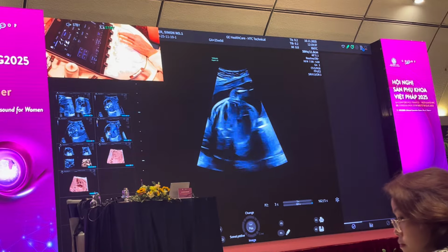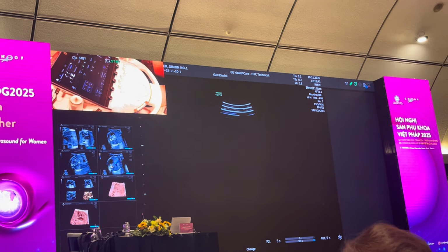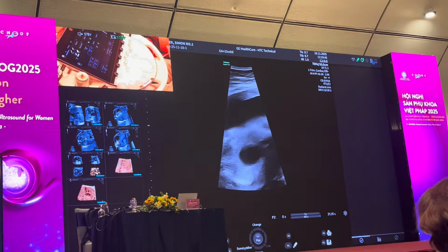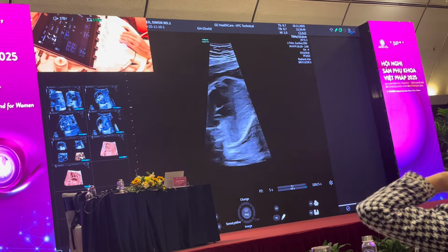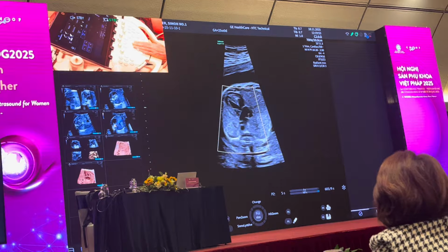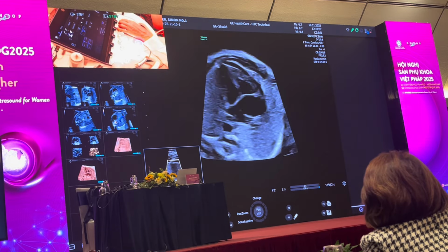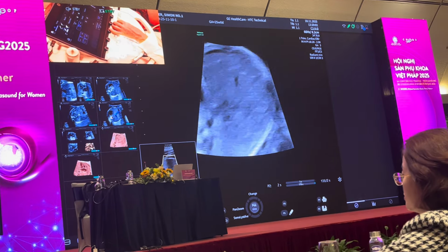So, my next step, having done that, is to switch my transducer, and now I'm going to go to C2 to 9, and I'm going to see the images are better with C2 to 9. So as I come across, look at the four-chamber view of the heart, I want to check the moderator band, I want to check the ventricular septum, and then I increase my acoustic output, slightly increase my gain.